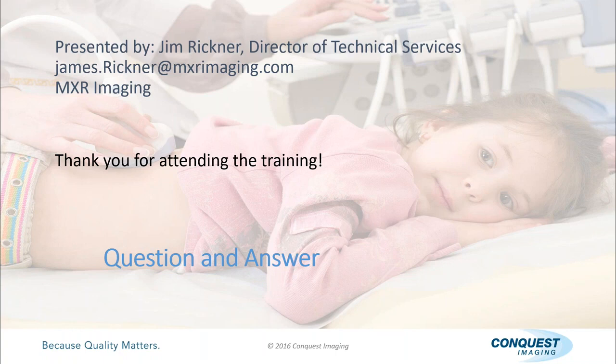But if you want a copy of this presentation, I'll give it to you, as well as the next one, which again, I don't take credit for. My name's nowhere on it. I'm just showing you, to me, it's a good document to have as a reference. Whoever did it did a really good job, as well as an ACR. Mine's just an Excel spreadsheet. It's several pages long. Tabs are at the bottom. It tells you this is what an OEM requirement for a PM is.